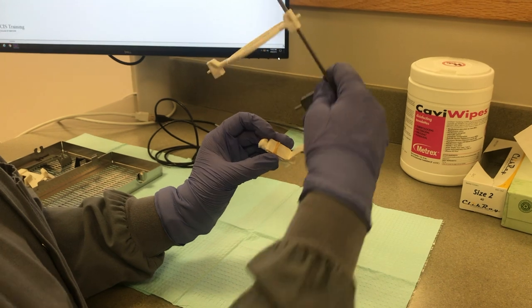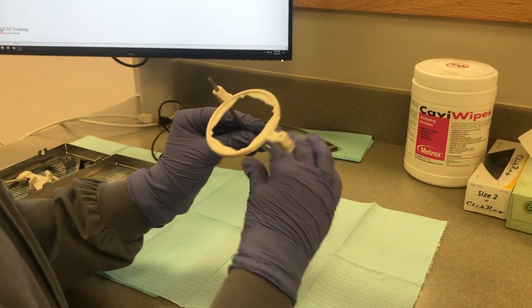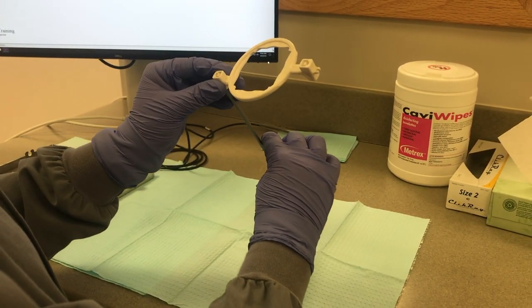For a left maxillary posterior periapical, flip the bite block and flip the ring like a pancake. Center the ring over the sensor.